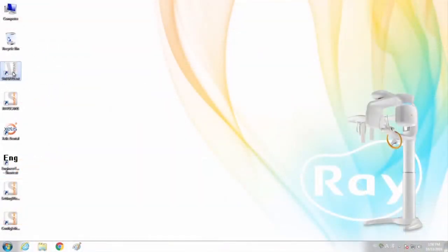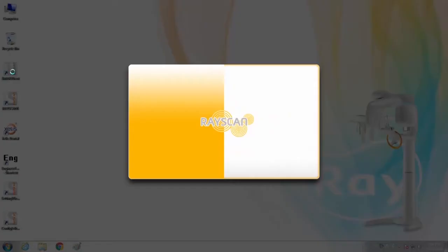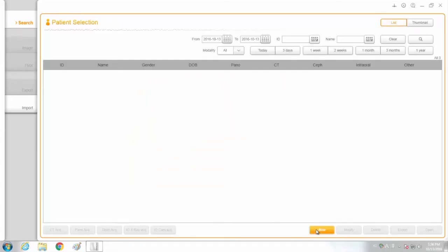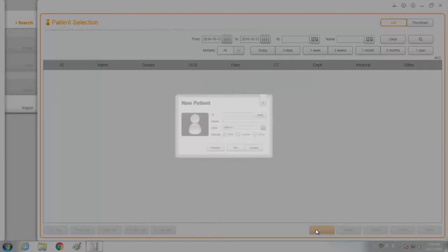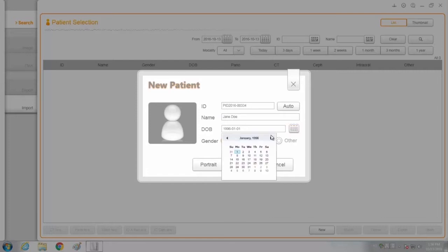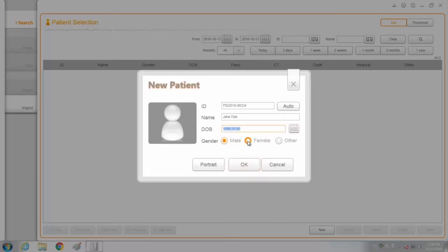Please execute Smart End and register the patient information. Click the New button and then enter the chart number, name, birthday, and gender of the patient. Then click OK to complete patient registration.